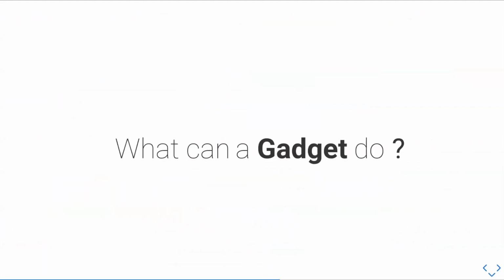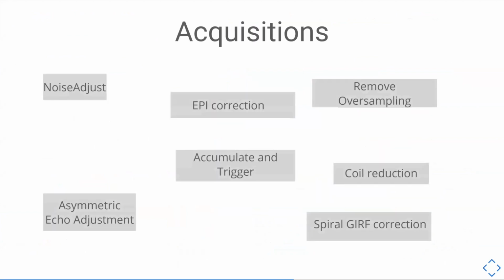Okay, so let's talk about what a gadget can do. It can do anything you want if you make it from scratch, but let's look at the gadgets that are already in Gadgetron when you download it. Now, the gadgets mainly operate on 3 different kinds of data. They either operate on acquisition lines, like individual lines of K-space, or on a K-space buffer, a complete K-space, or on images.